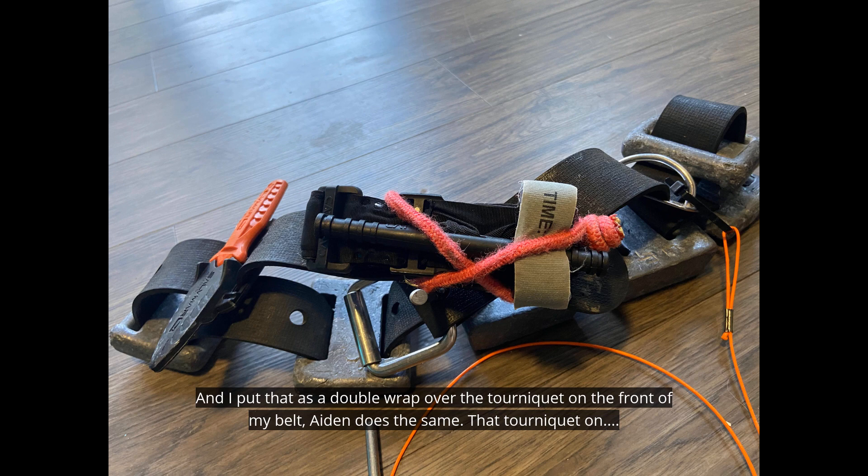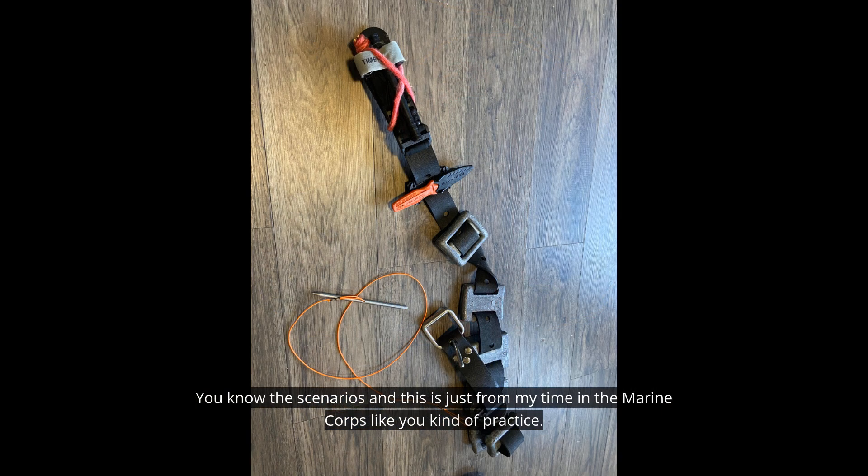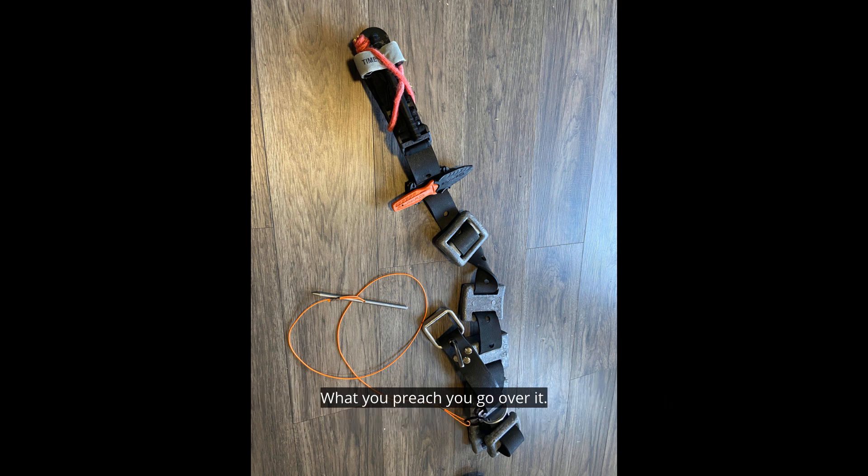Hayden does the same. That tourniquet on my belt is likely for him to grab to apply to me, or vice versa, or for myself. We've talked about the scenarios, and this is just from my time in the Marine Corps — you practice what you preach. You go over it, take it apart, know how you're going to pull together.